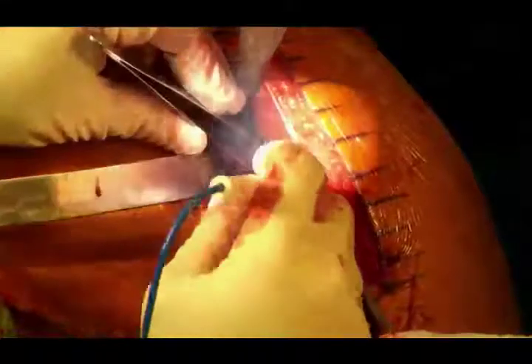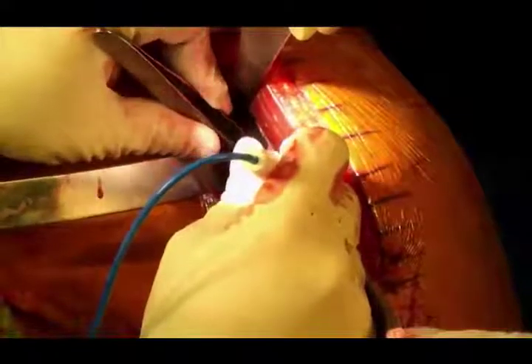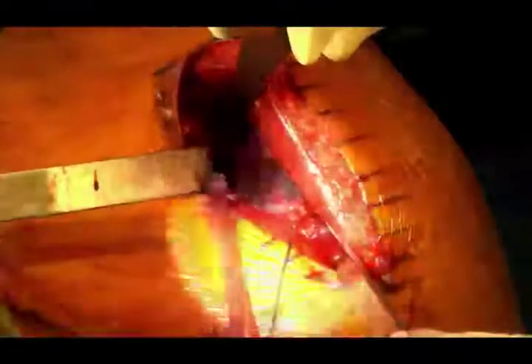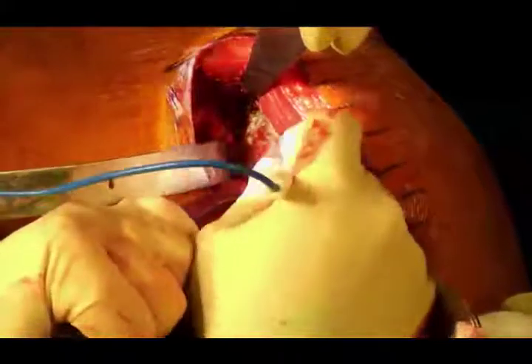It's almost magical when you get to 4 o'clock back there — everything opens up when you release the inferior labrum and capsule. I've already gotten everything I wanted. I'm running that release all the way posteriorly. I've planned this operation using the match point software, so I did virtual planning ahead of time.